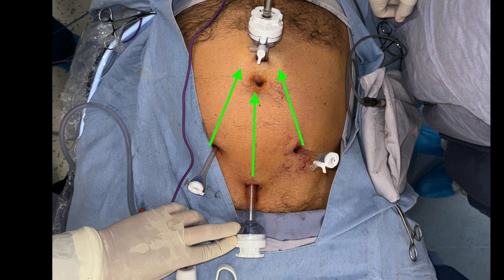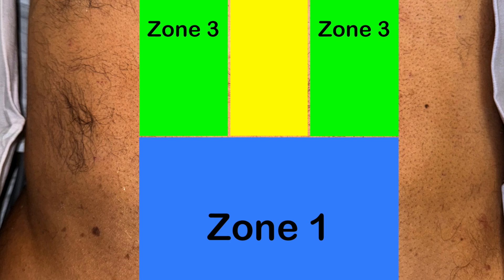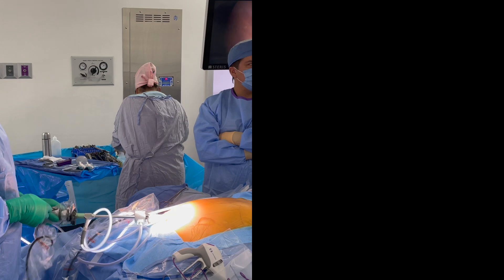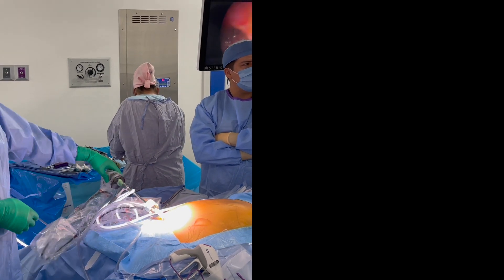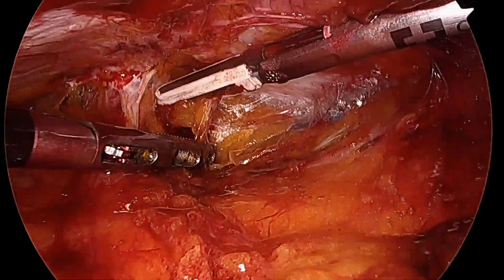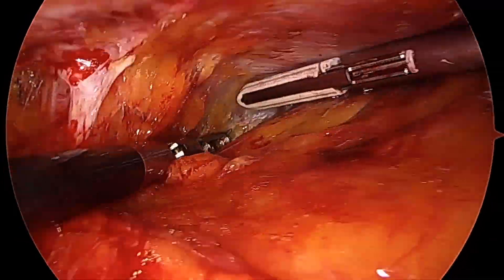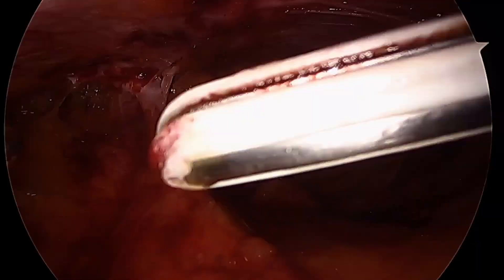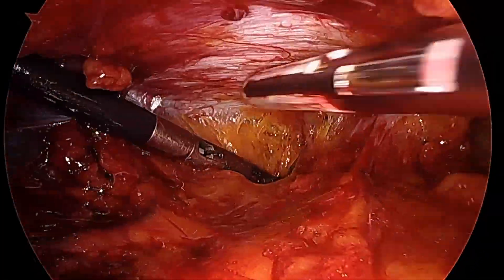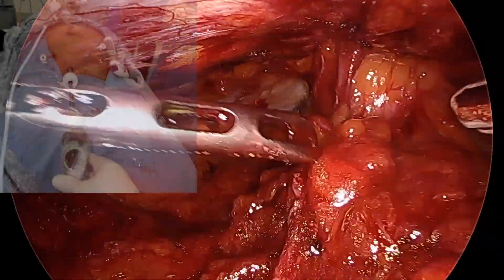For the first part of the surgery, this is the port placement. We start with a suprapubic port. We're going to dissect zone 1, and this dissection takes place after placing a 12mm port and is done through a telescopic dissection. Afterwards, we place the ports in, stay in the preperitoneal space behind the posterior rectus sheath, and keep dissecting on top of the median umbilical ligament until we make the progression from the median umbilical ligament to the falciform ligament.